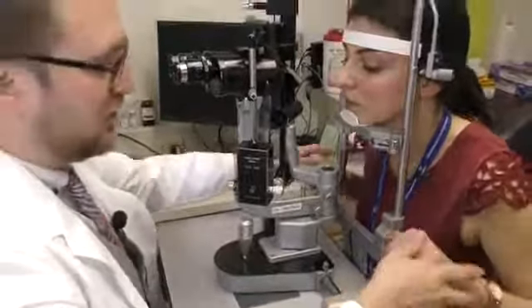Great. Now I want to show you the essential features of the slit lamp biomicroscope. So I want you to pay attention to just the elements that I'm going to show you. Anything more you don't need to know about, don't need to use. For your routine eye exam, these are the only features that are going to help you to get a good exam. Okay, so we start with this knob here. This joystick raises and lowers the entire base of the slit lamp. Okay, so if you see me, I'm turning it clockwise. The machine goes up. As I turn it counterclockwise, the whole machine goes down.